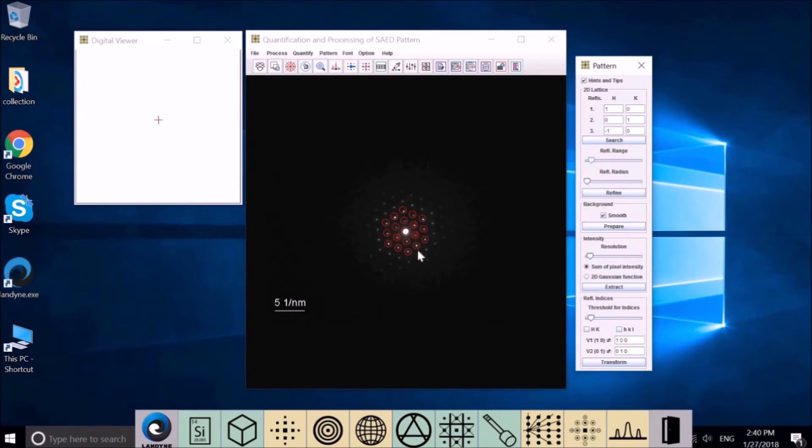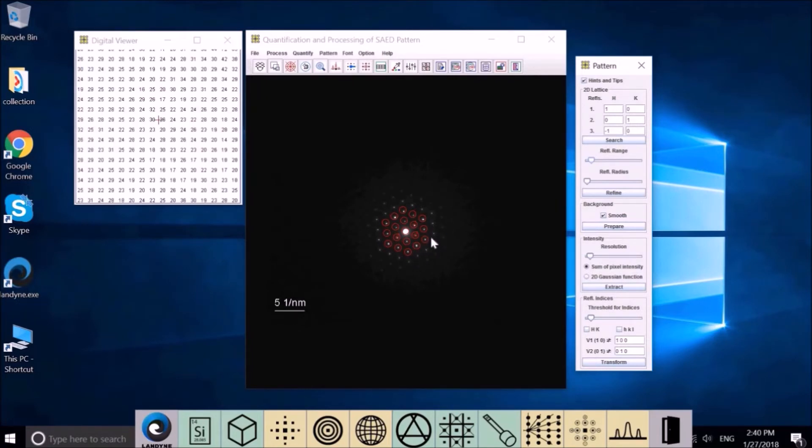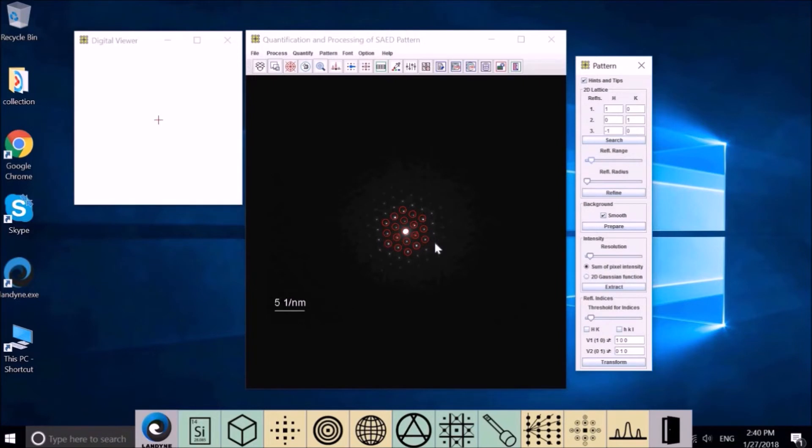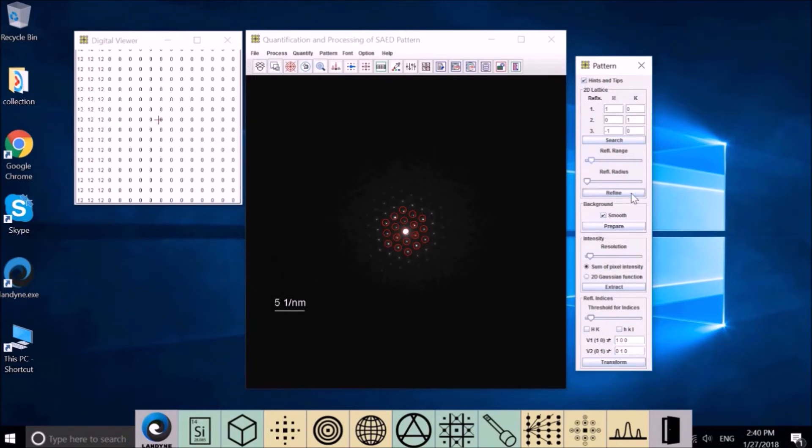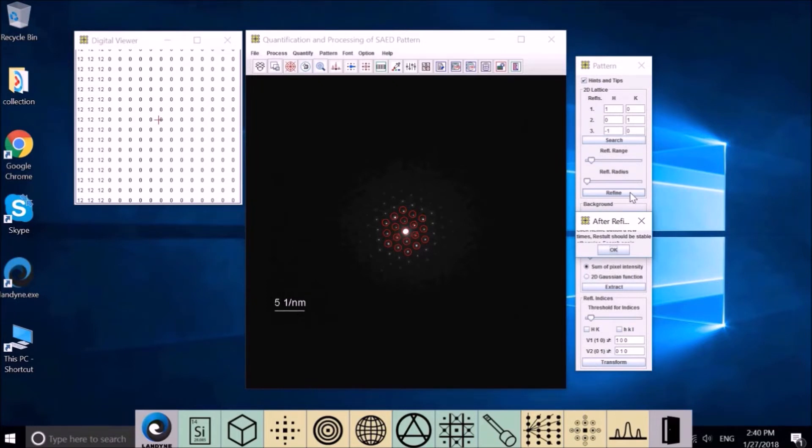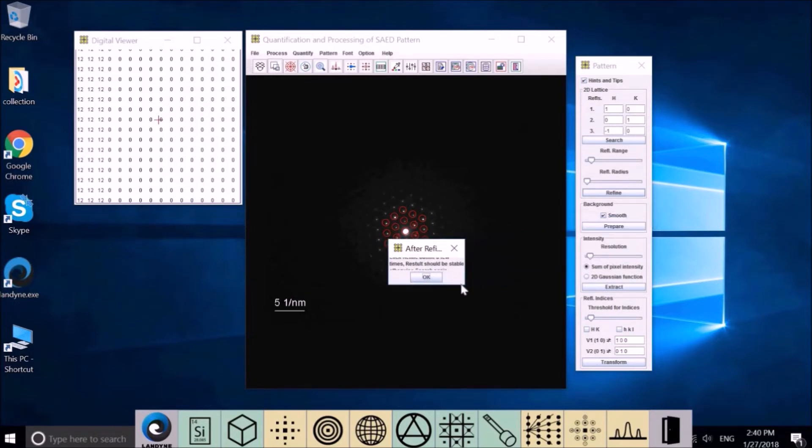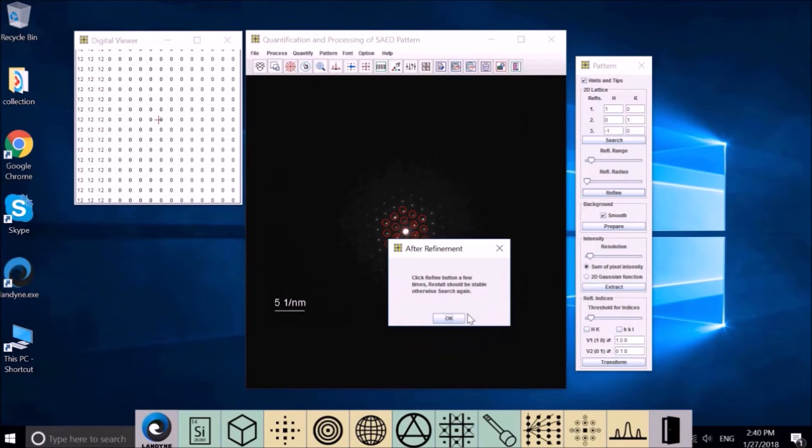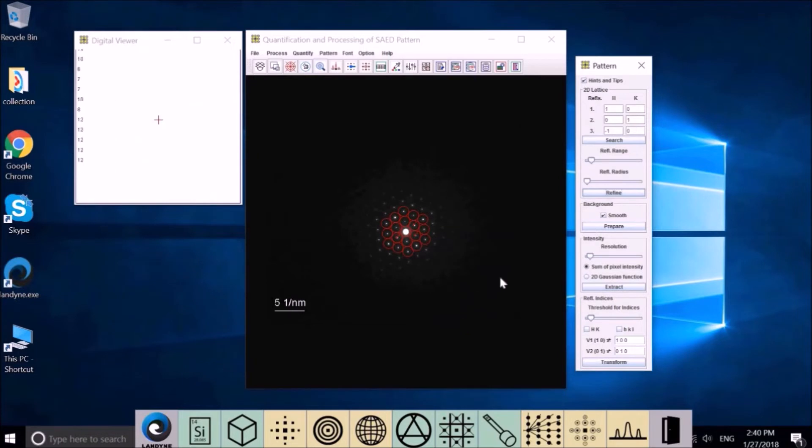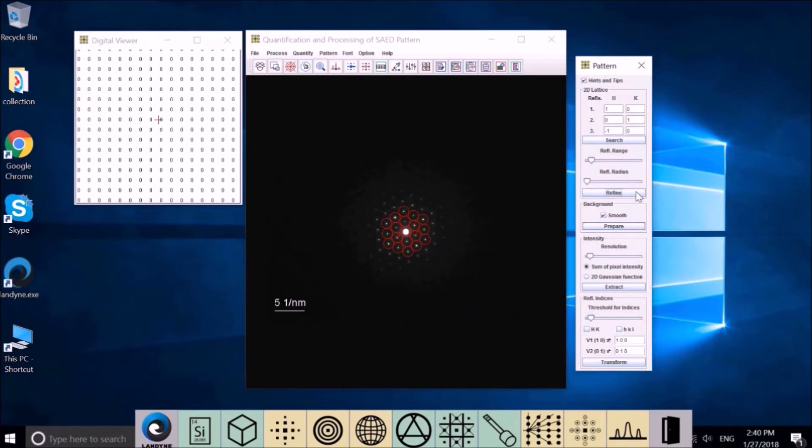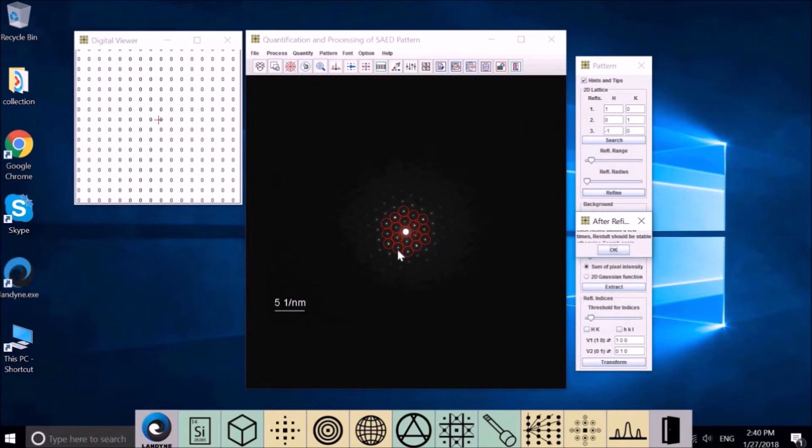For refinement, we just use the first ring and the second ring. And see all the spots in the circle. Now we can make the refinement. You may try several times for the refinement until it's stable. Click the refinement button a few times, and the result should be stable. Otherwise, search it again.